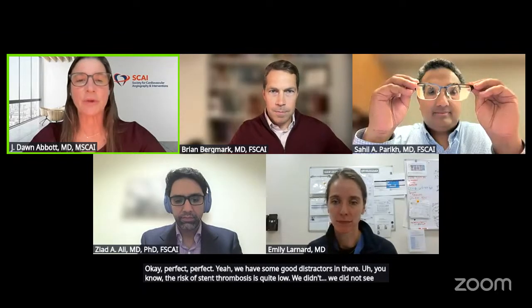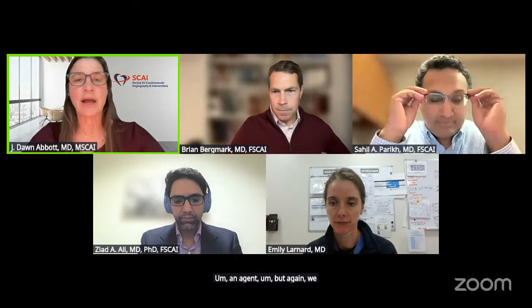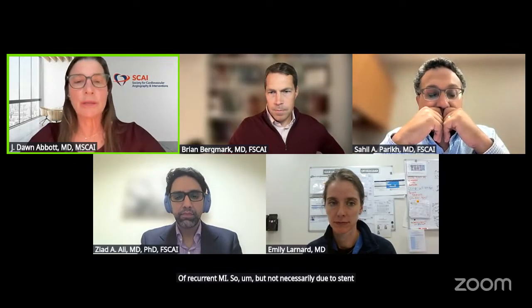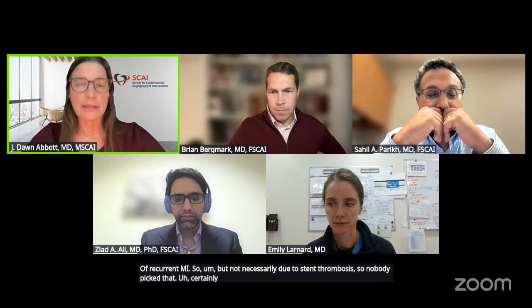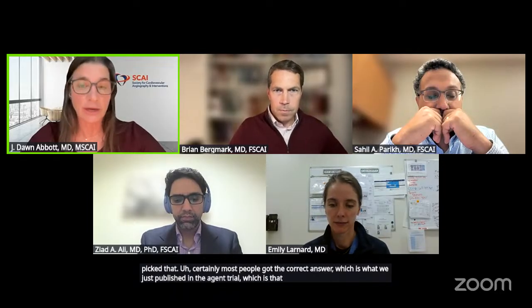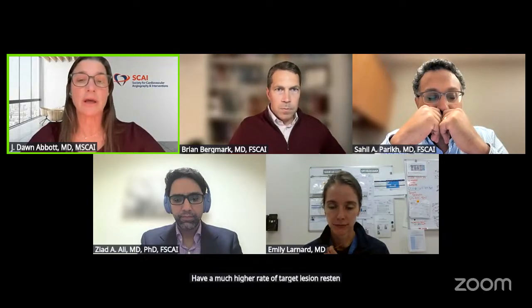Okay, perfect. Yeah, we have some good distractors in there. The risk of stent thrombosis is quite low. We did not see an increased risk of stent thrombosis in AGENT, but again, we did see higher risk of recurrent MI. But not necessarily due to stent thrombosis. So nobody picked that. Certainly, most people got the correct answer, which is what we just published in the AGENT trial, which is that double layer compared to single layer have a much higher rate of target lesion restenosis and target lesion failure.